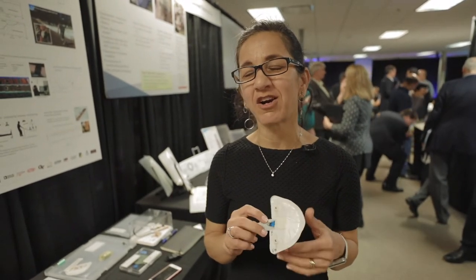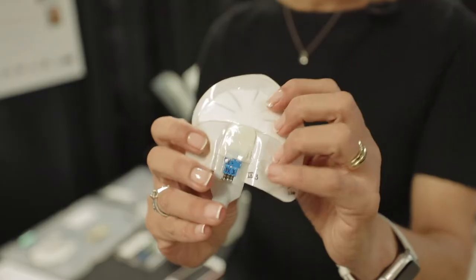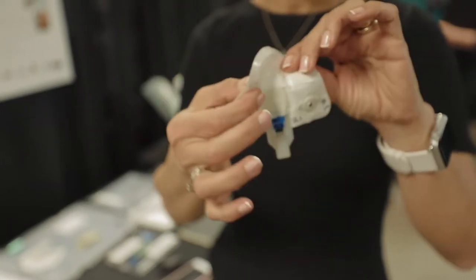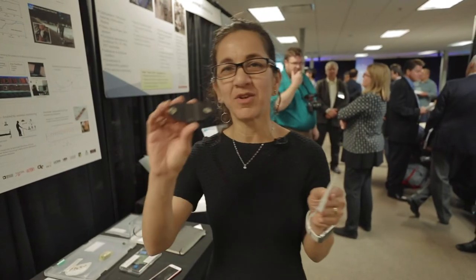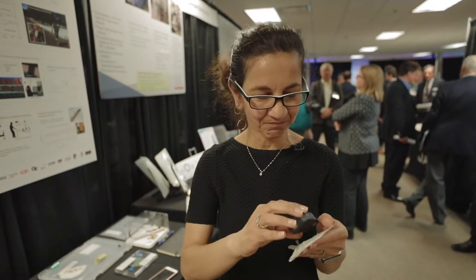We have been developing a sweat patch for a couple of years now that can measure hydration. The enablers from FHE have been crucial from a form factor standpoint. This patch has a component that includes the sensor and the fluidics, which is highly flexible, as well as a module that has all of the electronics in it for wireless transmission of the data.